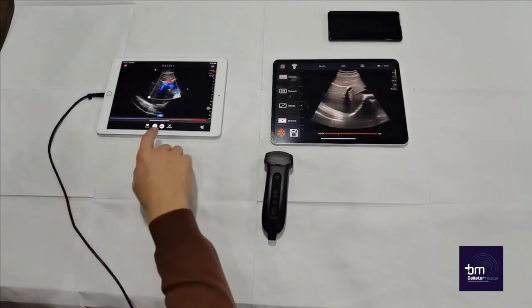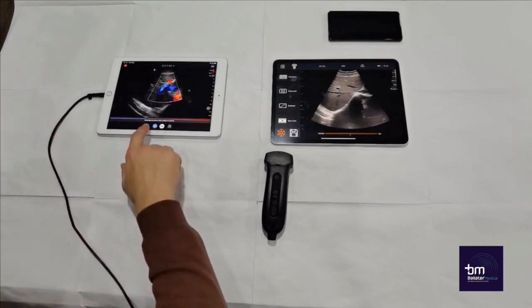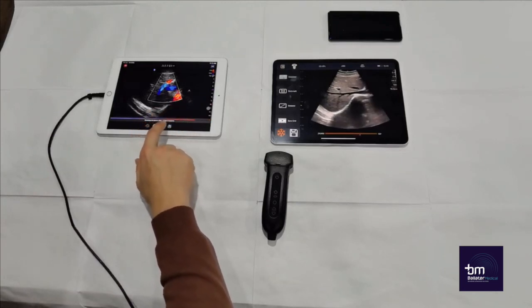Due to the Butterfly IQ having reached too high a temperature, the scanning has stopped. You would be able to continue scanning once the cooling is complete. However, having to wait for the probe to cool down may present problems in daily practice.